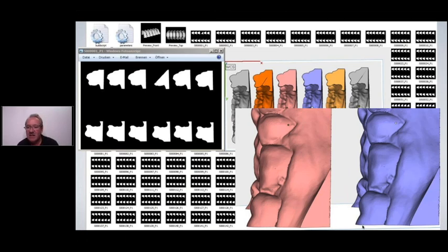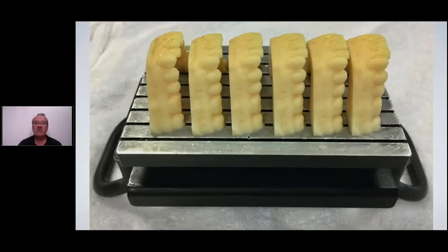It's flat, but it's a little bit darker, so a little bit is not touching the base, and because of that, you will get a misprint. So we have to tell the software to correct it and adjust it to the right position, and then we will get very, very nice prints.